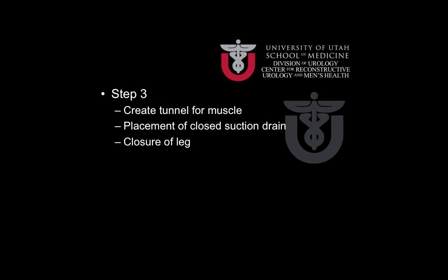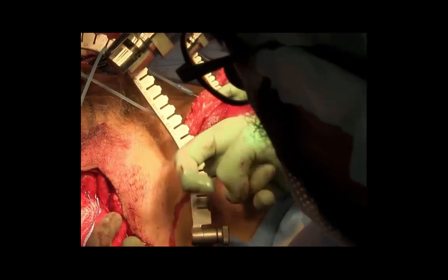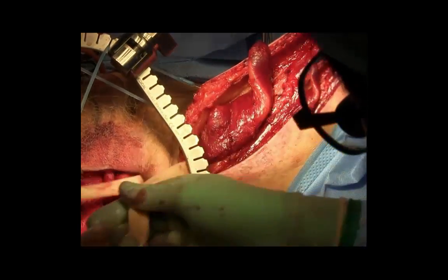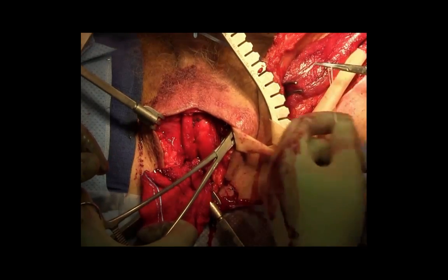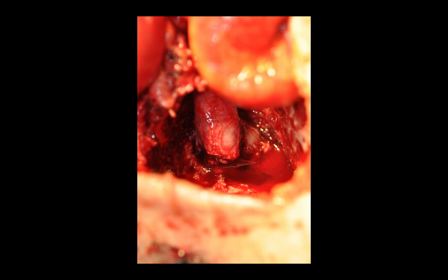The next step of the procedure involves creation of a tunnel for passage of the muscle into the perineum, placement of a suction drain, and closure of the incision in the leg. A blunt window is created underneath the remaining skin between the vascular pedicle and the perineal incision for passage of the gracilis muscle flap. A Penrose drain can aid in retraction of this tunnel. A large vascular clamp is now used to pass the gracilis muscle flap into the perineum. Dissection of the vascular pedicle allows a bit more length of the gracilis for application in the perineum.